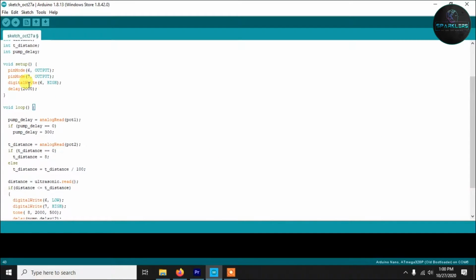Now here is another thing. If you see, in the setup part I am writing digital write 6 high. So I am making pin number 6, the relay pin, high. Now this is because it varies from relay to relay. For a few relays, if you make the pin high, it will connect the middle pin with the disconnected pin. In my case, the right pin I have shown you. And for a few relays, if you make the pin low, they will connect those two pins. So it varies from relay to relay.